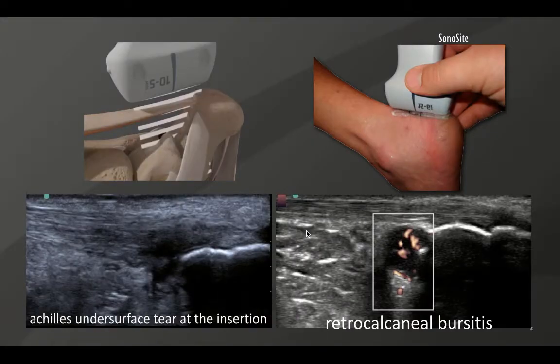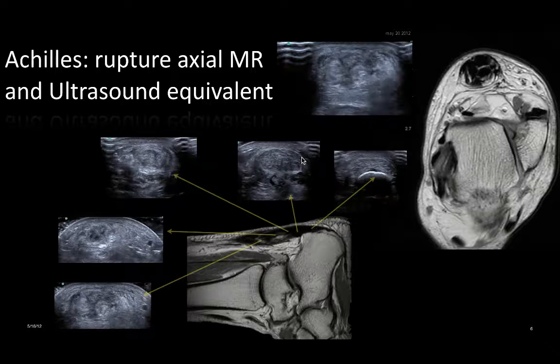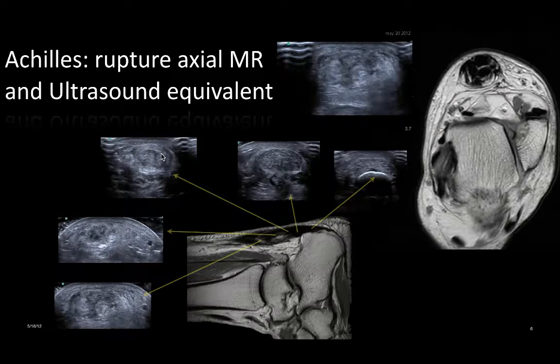The enthesis is noted here, and we don't see fibrillar disruption just yet. At the mid-substance of the insertion, just shallow to the malleolar level, we start to see extreme thickening of the overall tendon — but it's not diffuse like tendinosis. This is swelling of the tendon; its diameter has changed drastically. The fibers themselves become more separated and disrupted. Then we see a complete rupture of fibers in the central portion of the tendon, and then it starts to swell back out again, much like we see in the MRI.